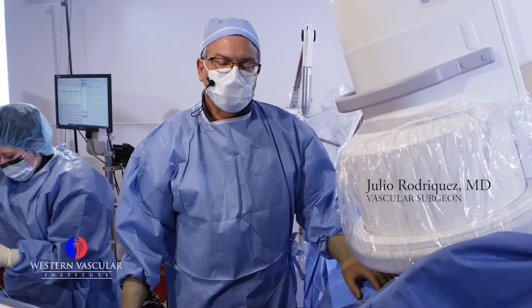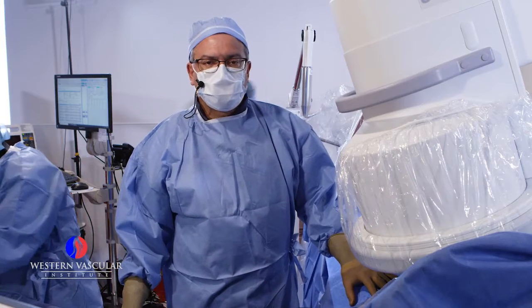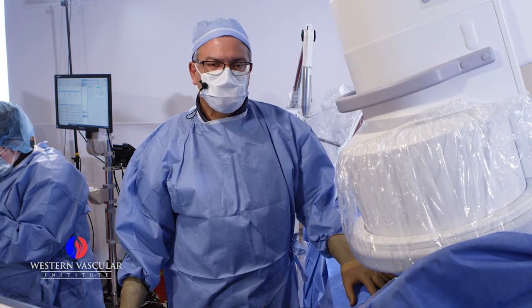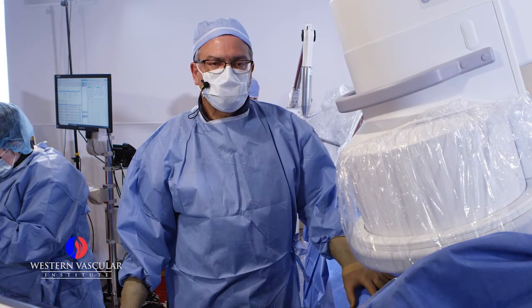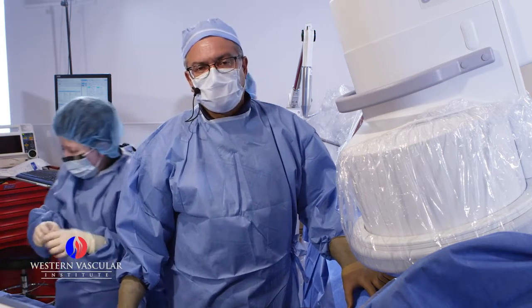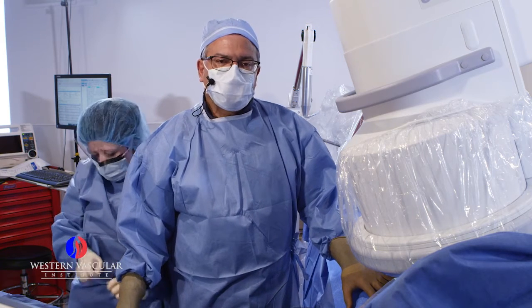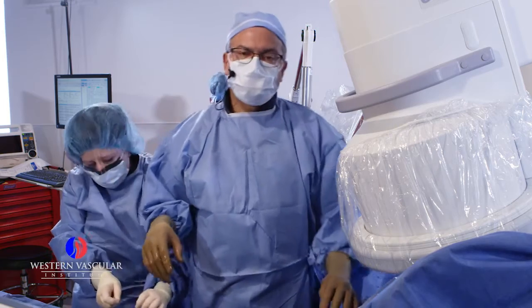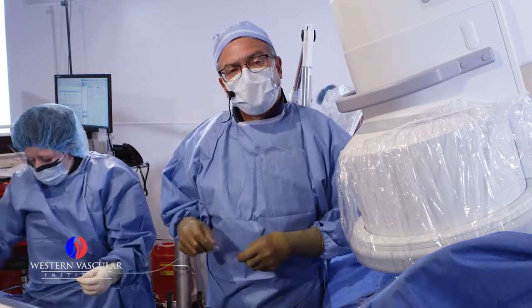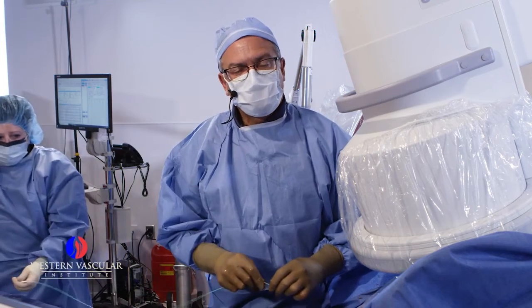Hi, we are in the Angio suite, and we have an interesting case this morning. This lady is in her late 70s, and she presented to us with a long-standing history of vascular blockages in the legs. This is an example of how plaque and atherosclerosis disease can affect the circulation of the leg and make the patient suffer difficulty walking and doing just basic activities during the day.